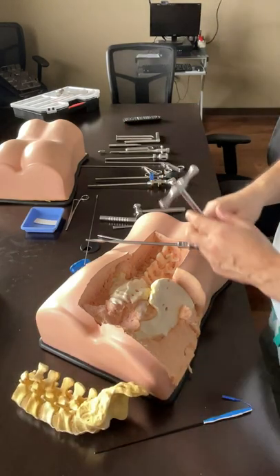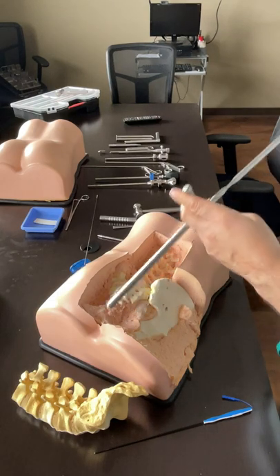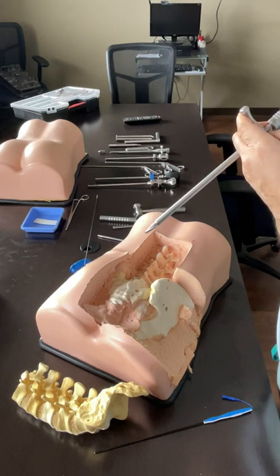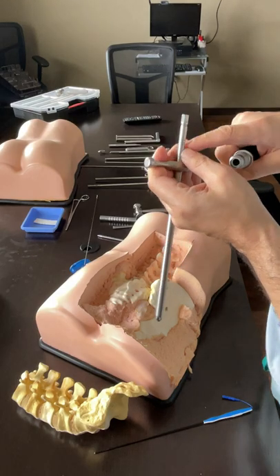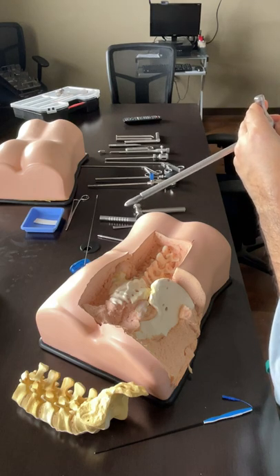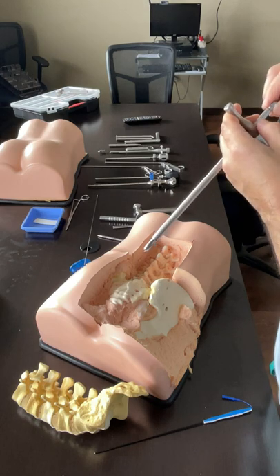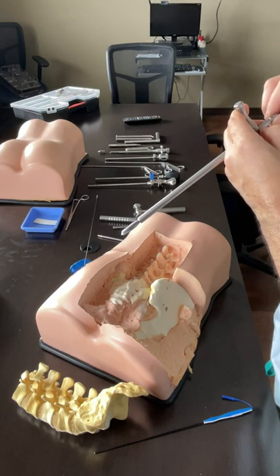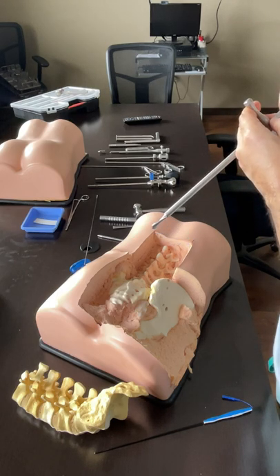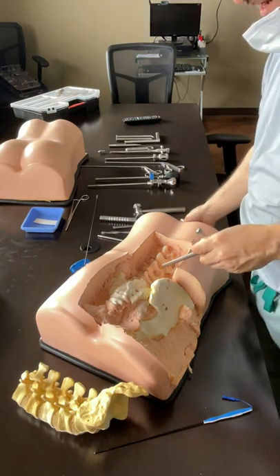So, half of the pedicle to the entire pedicle in the AP, and half a centimeter to a centimeter in the lateral - this is the proper positioning. Get an x-ray, make sure it's not more than that in, and get lots of x-rays when you are doing that. You go in and create a path, a cavity. These lines are 27, 30, 33 millimeters. Once you create a cavity, you can fan it a little back and forth to make that cavity bigger, and by then you know what length of cage you are going to use.